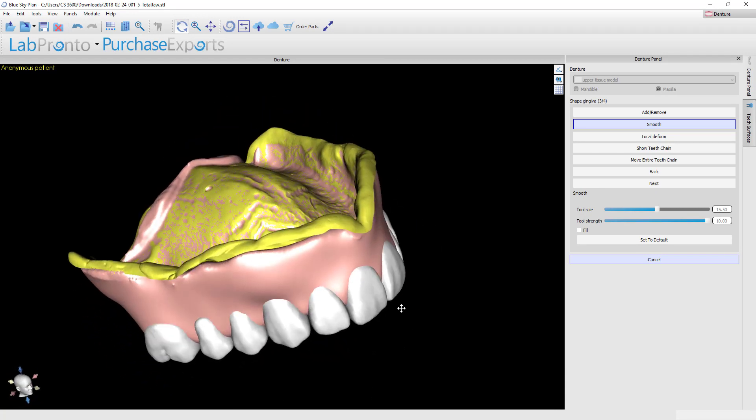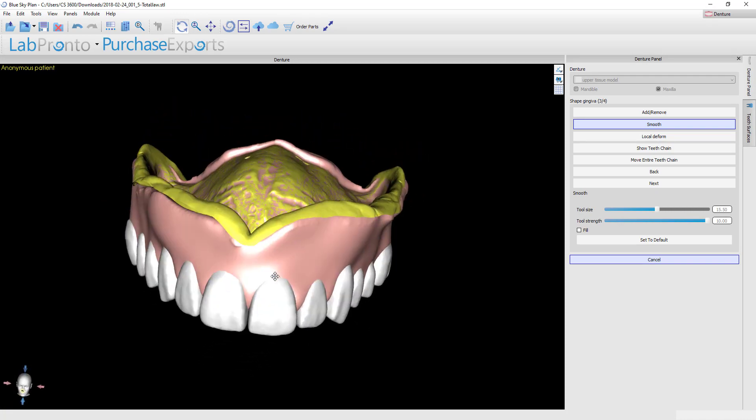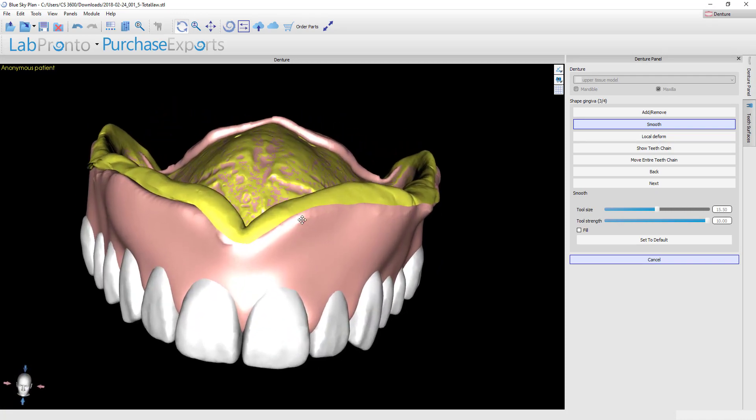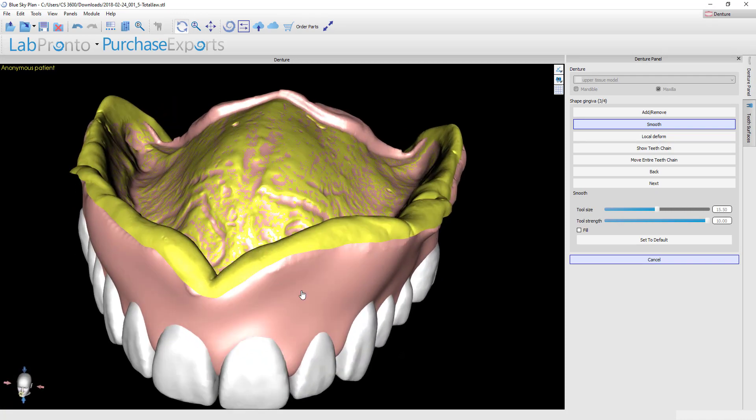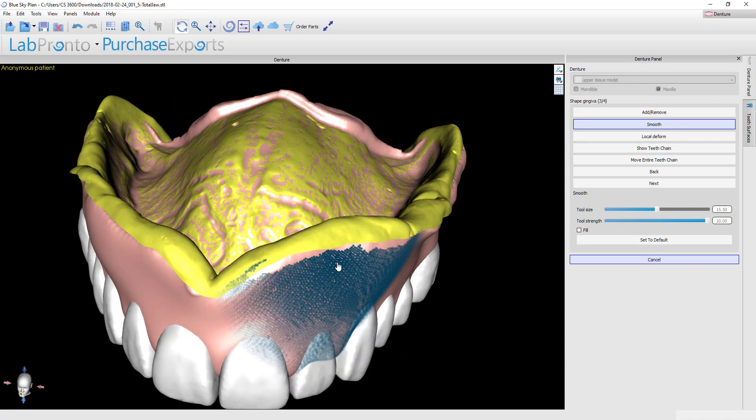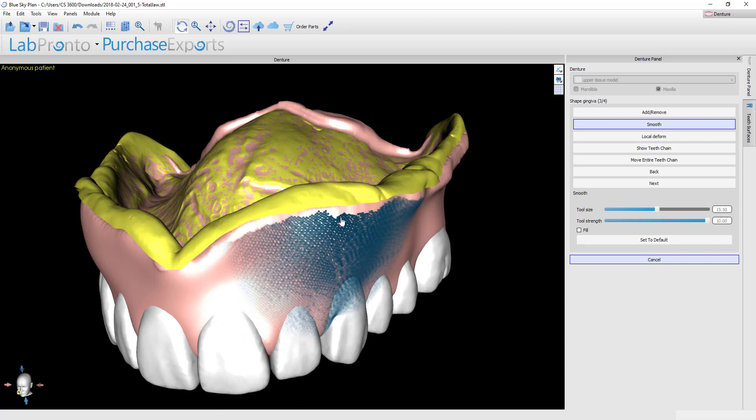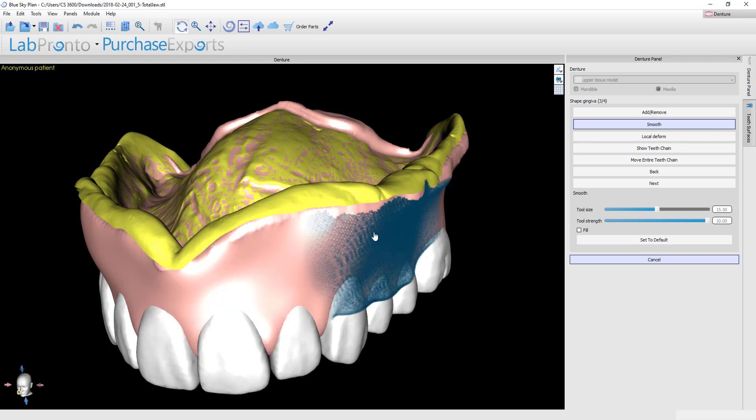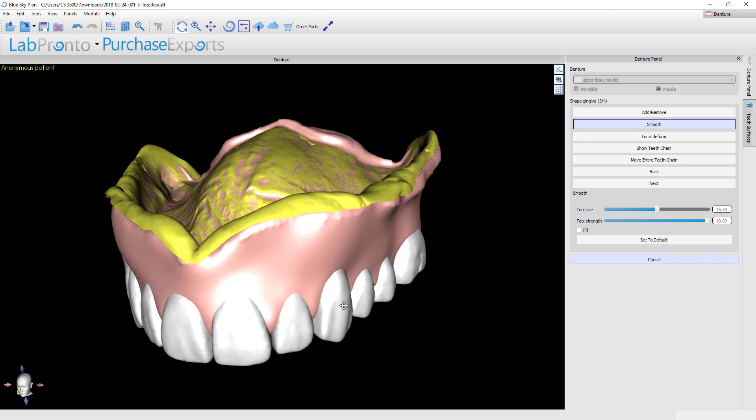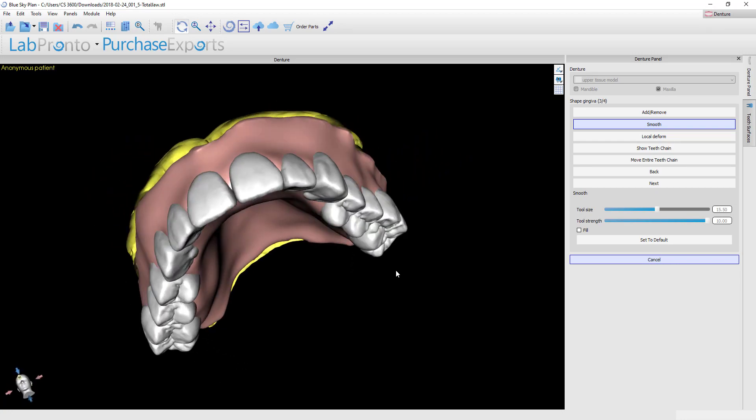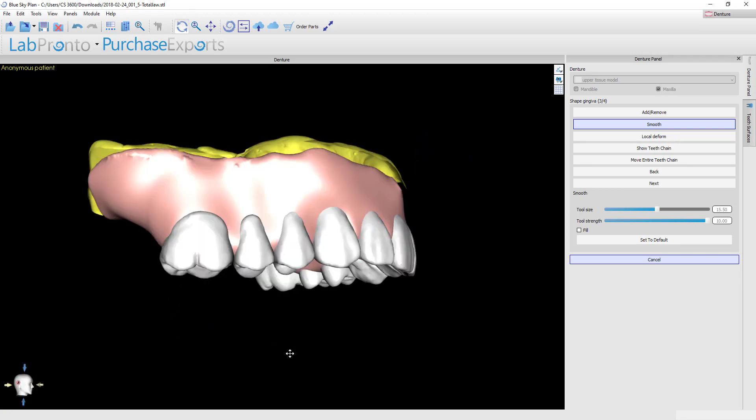I meant to also mention earlier that you don't have to worry about your tools altering the internal surface here. As you see when I look from above, my tool does not roll over onto the internal surface of the denture—those are protected areas so that you don't have to worry about that and you can take your tools all the way to the border and not cause any changes on the internal surface.